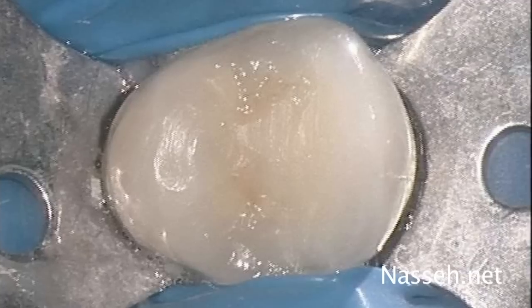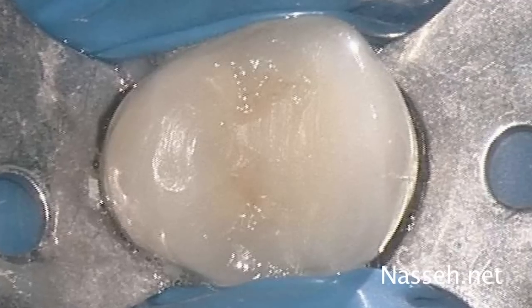It is crucial that the cutting be done carefully to avoid accidentally damaging the silver point handles. Silver is a very soft metal and this mistake would be very costly, as removal of the silver point is far more difficult without the handle than if the handles were kept intact. Therefore, following anesthesia and isolation, access was made through the crown aspect of the tooth.